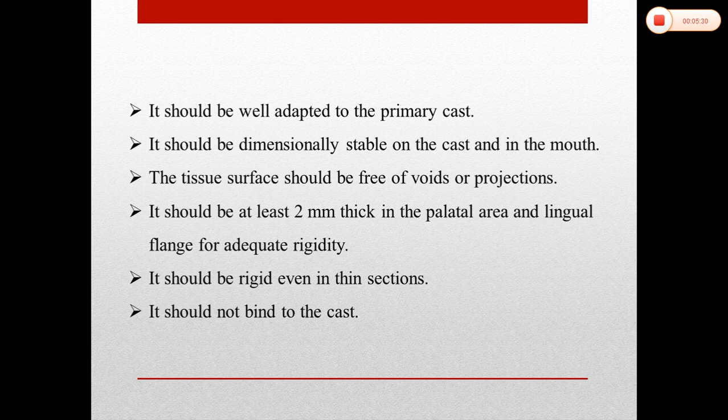The areas where the stresses have to be relieved, those structures have to be protected. For this purpose, we need a special tray so that we can carry our impression material in it to make a better impression for the healthiness of the tissues in the oral cavity.